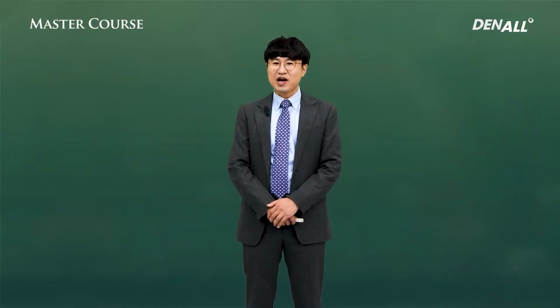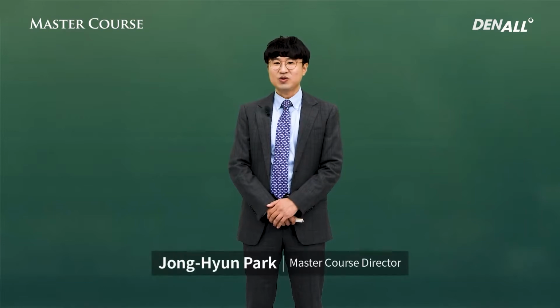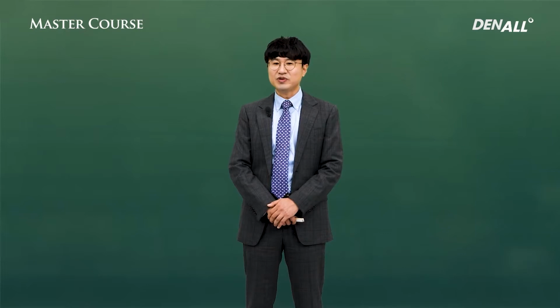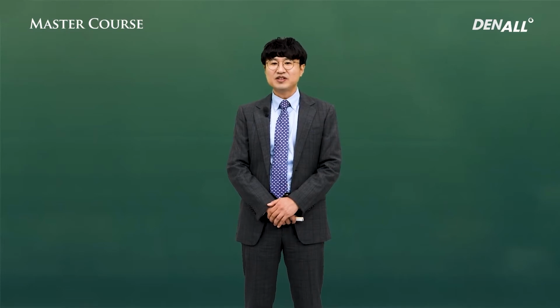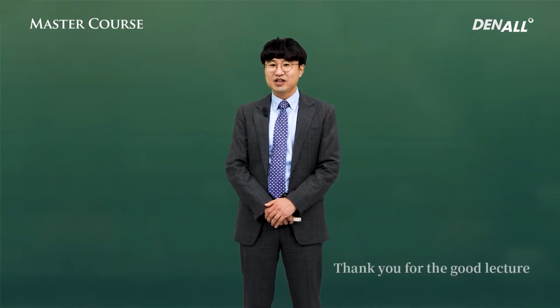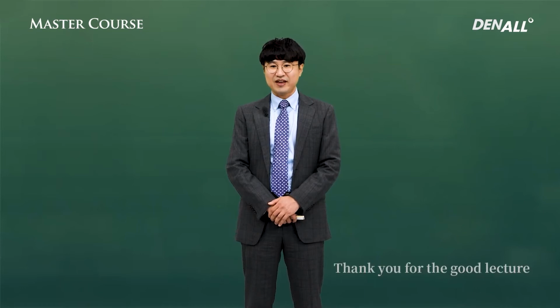A tooth shows various characteristics depending on its shape, its relation with the surrounding teeth, and dentition. After an implant is placed, an abutment is used to support the prosthesis. It would be actually impossible for such an abutment to completely satisfy all the characteristics of each tooth. However, based on this lecture, what about choosing the right abutment according to a tooth? Enhancing patient satisfaction is up to you.